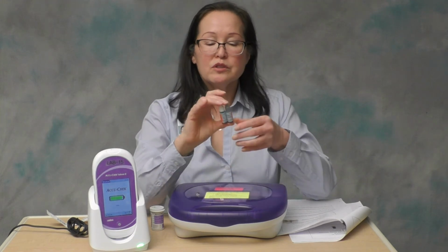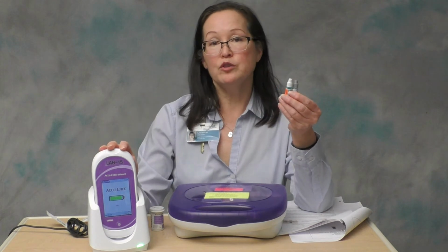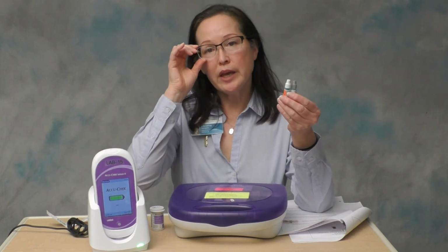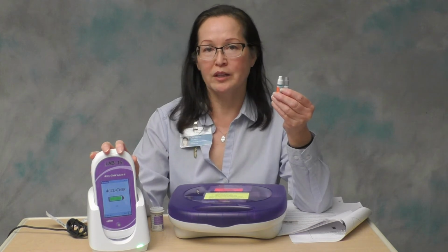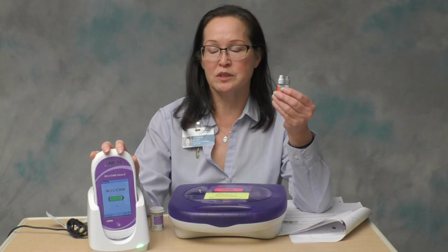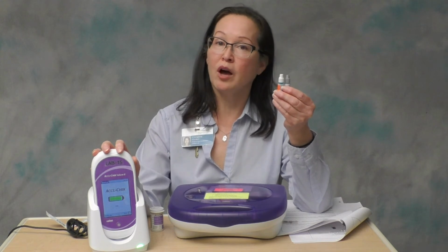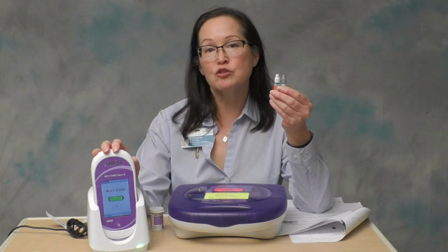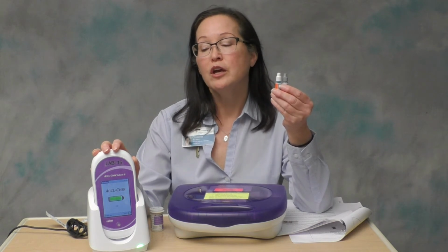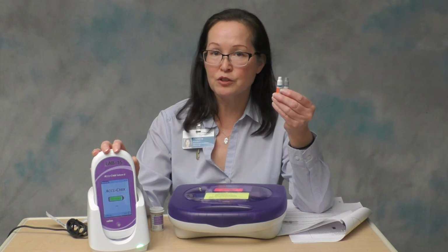These quality control solutions are run on every meter every 24 hours, and this is how we check the instrument to make sure the instrument is functioning correctly and giving you accurate test results. The instruments have a 24-hour QC lockout, so if QC has not been performed on that instrument in over 24 hours, you won't be able to run a patient test until you run QC first.